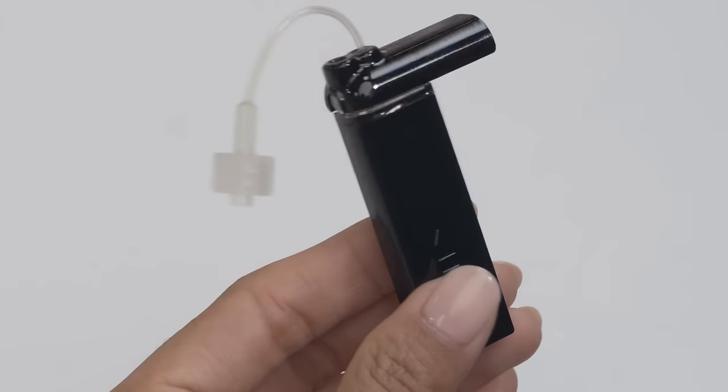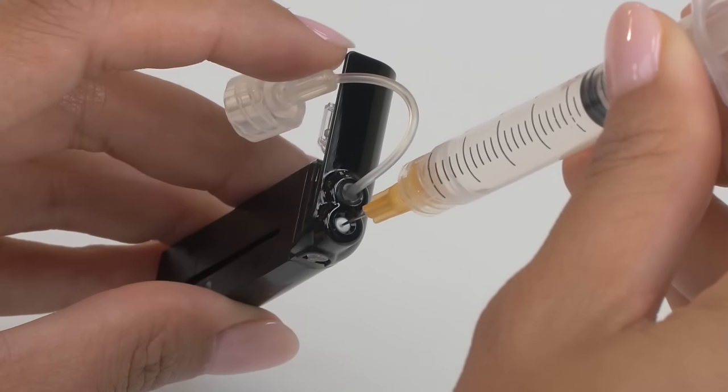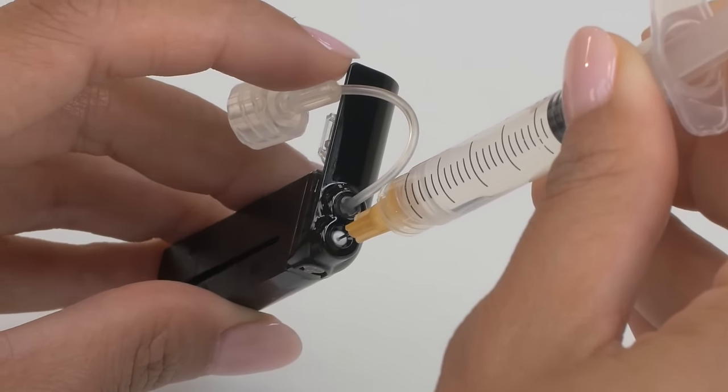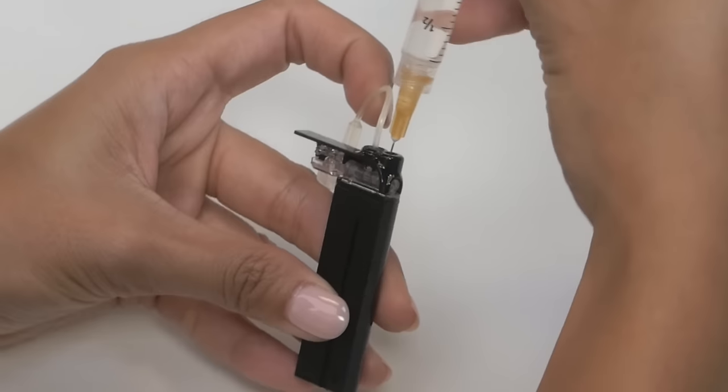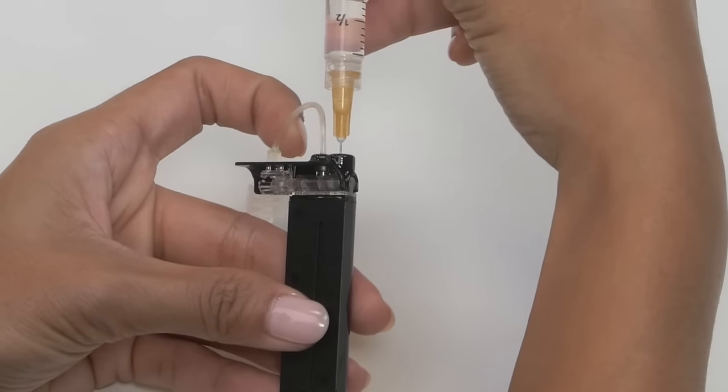Next, holding your cartridge upright, insert the needle into the white fill port on the top of the cartridge. It should stop about halfway, but occasionally will go all the way in. Either way is fine, but do not try to force it once you feel some resistance.